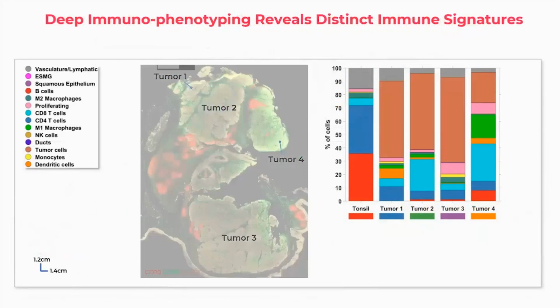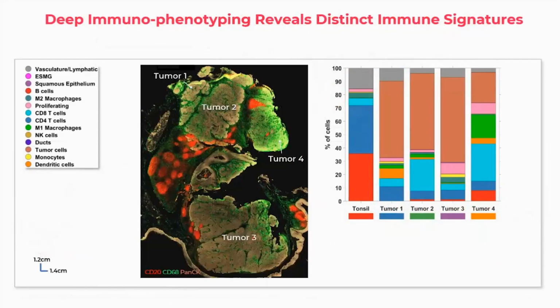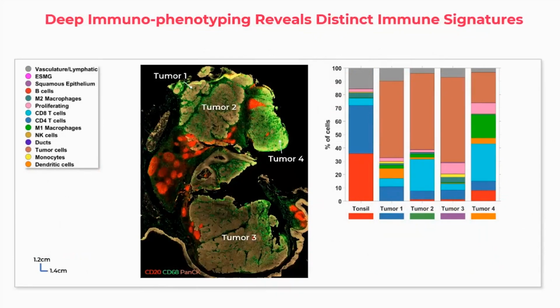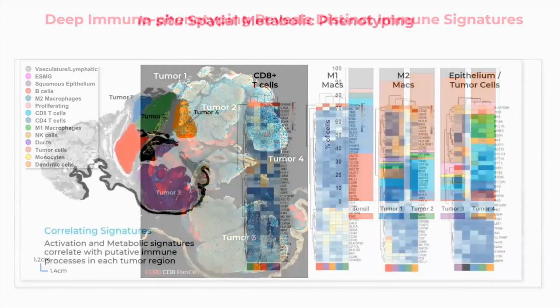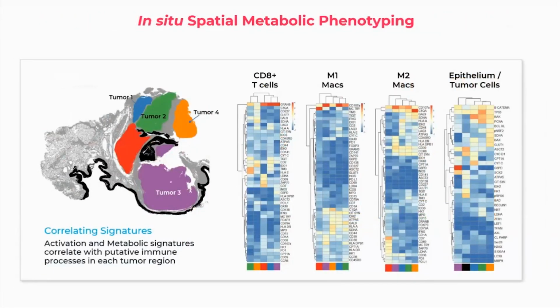We looked at broad markers that pathologists look at. CD68 in the green, it's highly infiltrated. You might say there's more at the top than the bottom. CD8, again, highly infiltrated, probably more at the top than the bottom. But what was really powerful to see was when we looked at the metabolic data on this tissue.